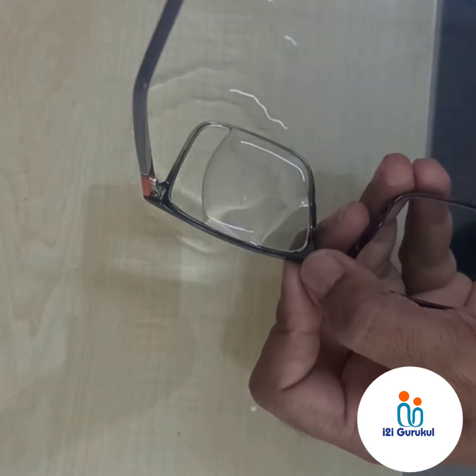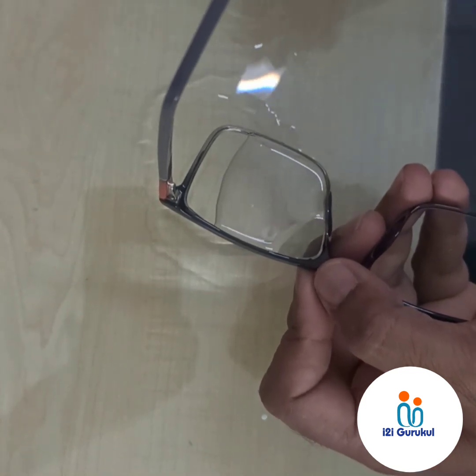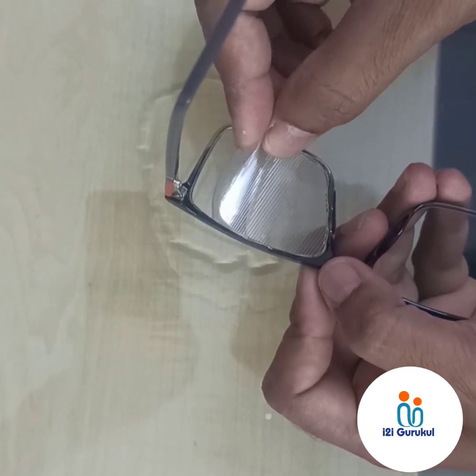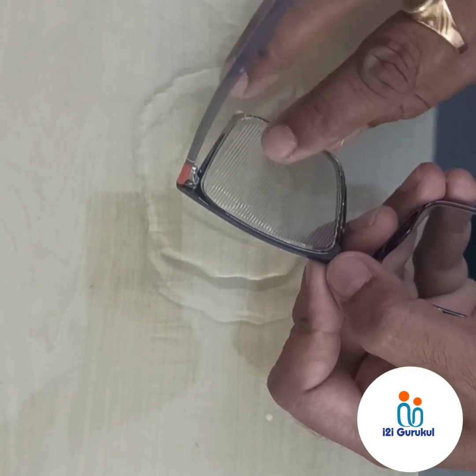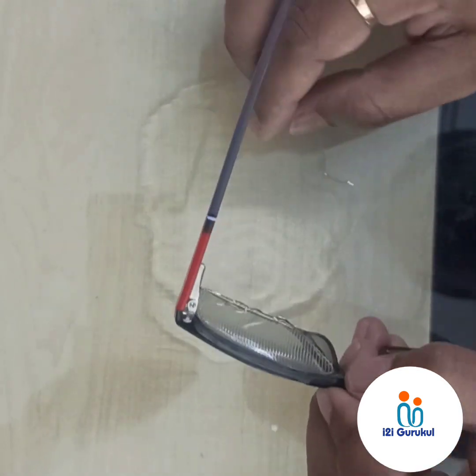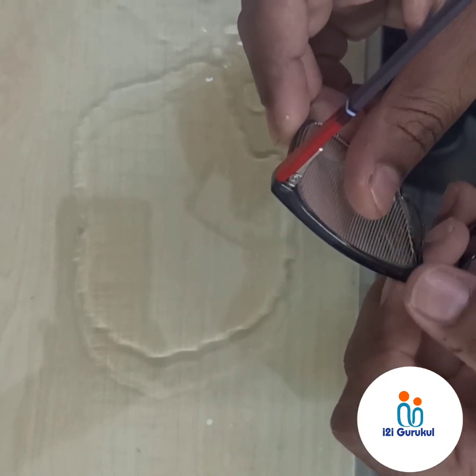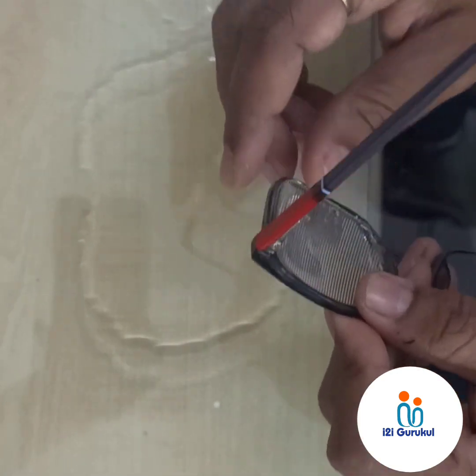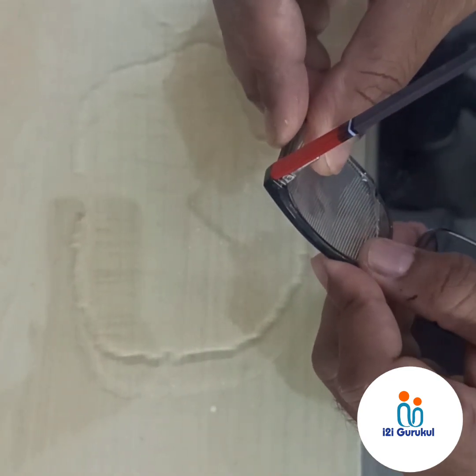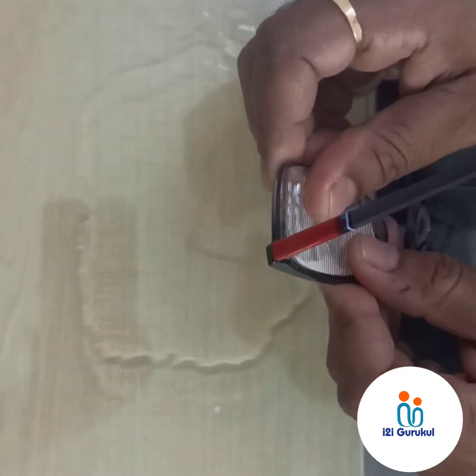Before fixing your Fresnel prism to the spectacle lens, please make sure that both the lens surface and the Fresnel prism surface are cleaned properly — they should be lint-free and dust-free. You can use drinking water or running tap water to fix the Fresnel prism. Gently press the Fresnel prism towards the spectacle lens so that it will flush out all extra water and adhere to the lens. Before keeping it to dry, check for any air bubbles or dust particles between the Fresnel prism and the spectacle lens.